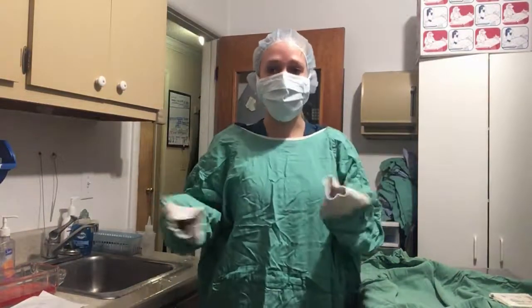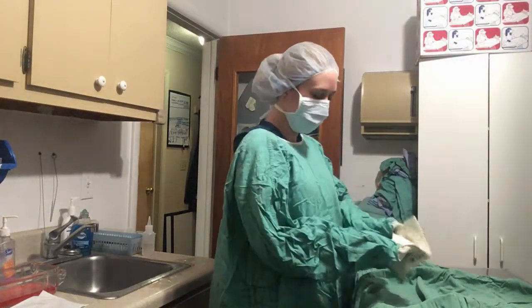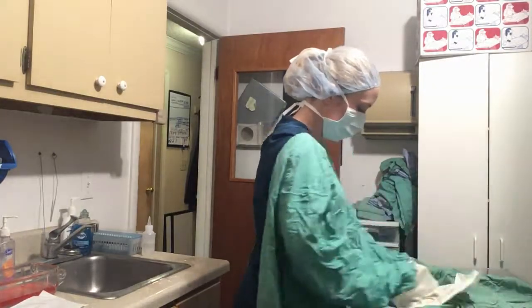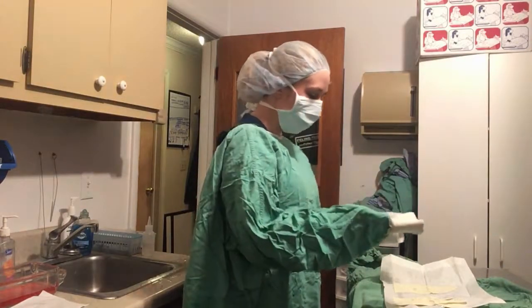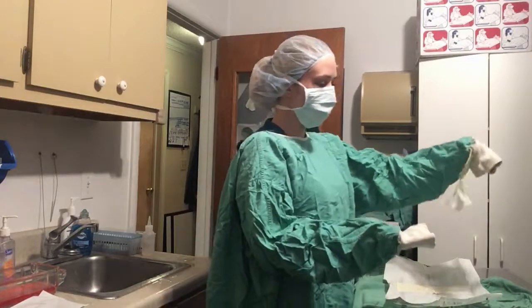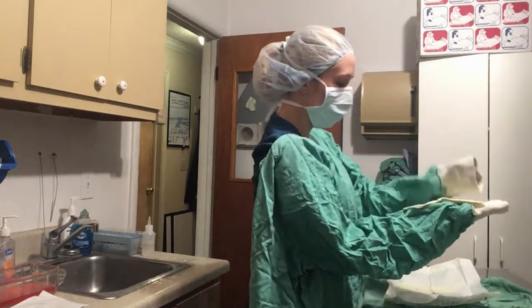So now I'm going to demonstrate a closed gloving. So I'm just going to go ahead and open up my gloves. Now with my hands still in the gown, I'm going to grab onto the end of the glove with my closed hand. And I'm going to place the palm of the glove on the palm of my hand.